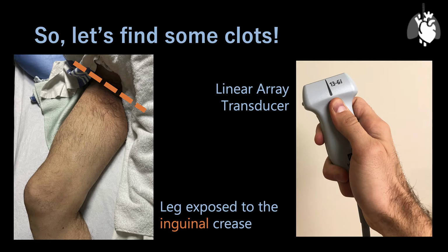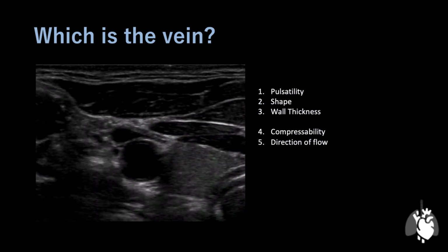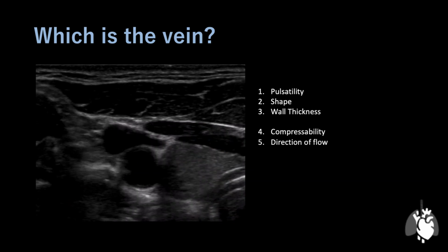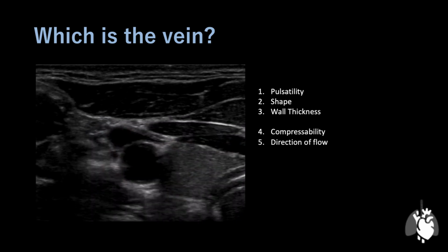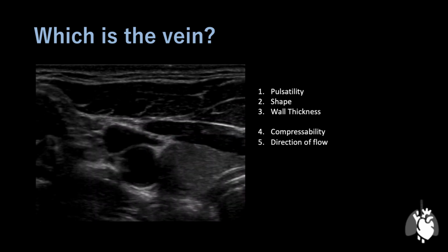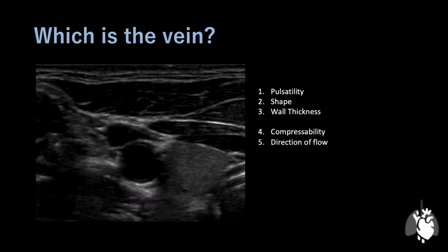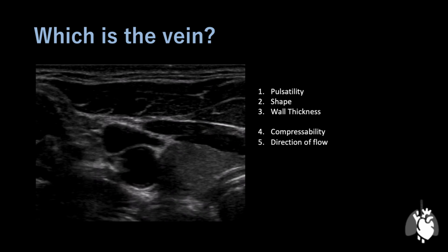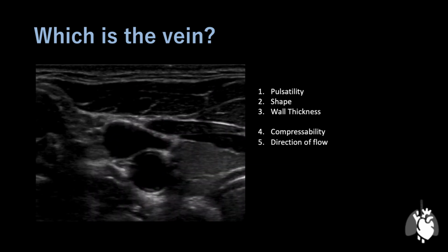Now, what do veins look like? Differentiating artery and veins by ultrasound can be tricky. They're almost always paired, and arterial and venous blood are equally anechoic. The major features to differentiate arteries and veins on ultrasound are not that different than the ones that you memorize to differentiate the JVP and carotid when you're a medical student on internal medicine. Pulsatility and compressibility are key. Veins are most easily compressible, and arteries have a regular pulsatility and are quite resistant to compression.